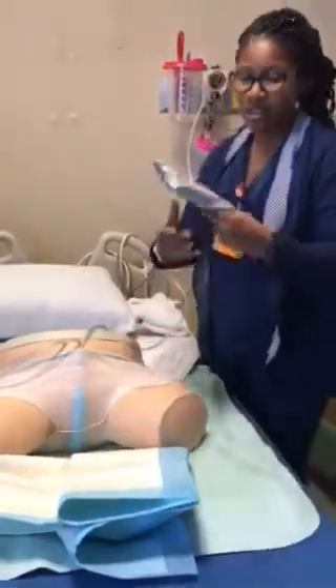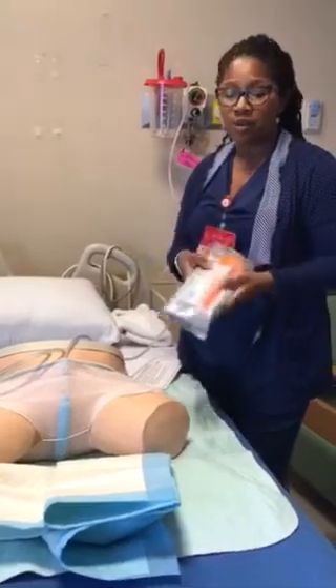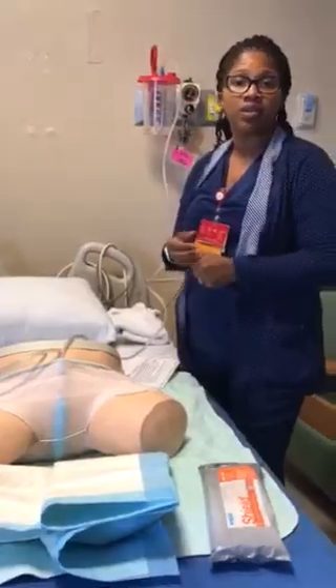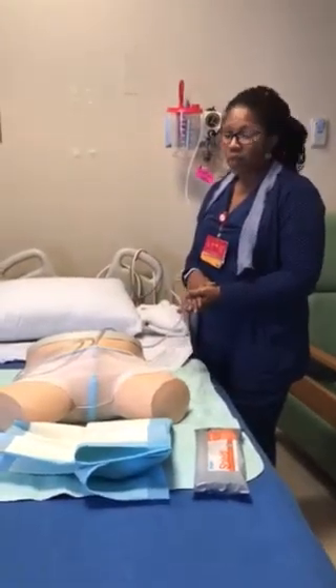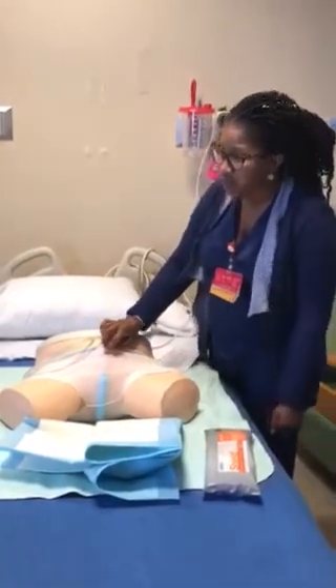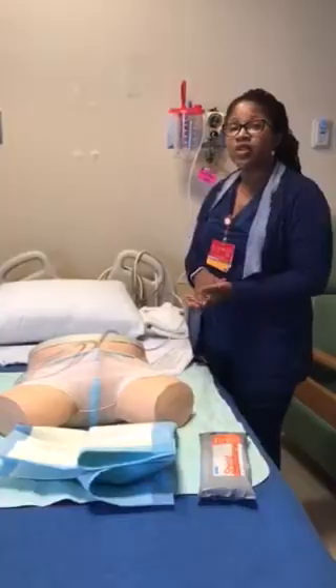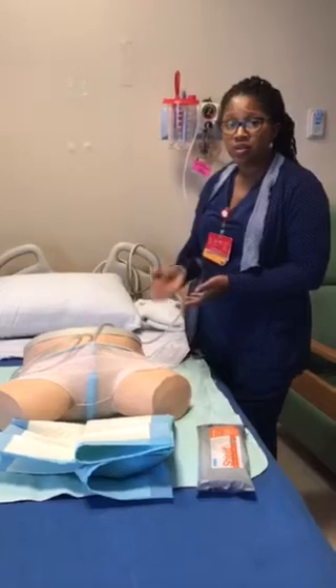You want to make sure that you're using your wipes and cleaning that area prior. For Meditech, documentation is going to be charted under the external condom catheter area. Also, make sure that you're changing it out once a shift or every 12 hours to keep it clean. At that point, you should assess the skin and make sure that it's still dry and intact.